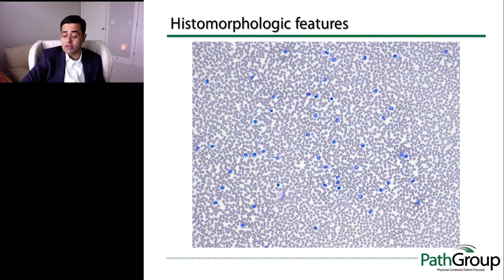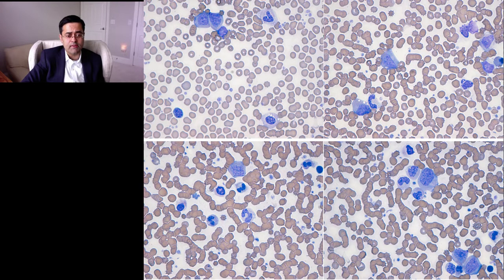They are granulocytic cells. On higher power, here you can appreciate that they are granulocytes. Many of them are so-called left-shifted, which means that they are not mature. They're not completely immature. They're not blasts, but they are stuck in the middle of being mature white blood cells and immature white blood cells. And there are some changes that you see here that a pathologist would call atypical. There's cytologic atypia. I wouldn't say there is frank dysplasia, and that's important in the additional workup of these tumors.